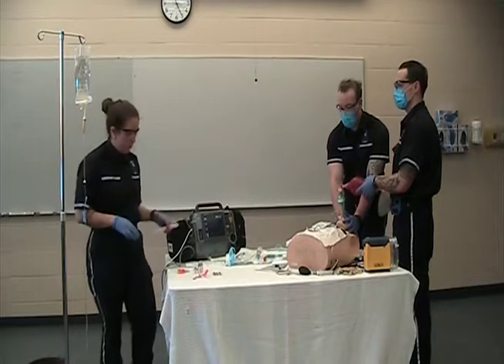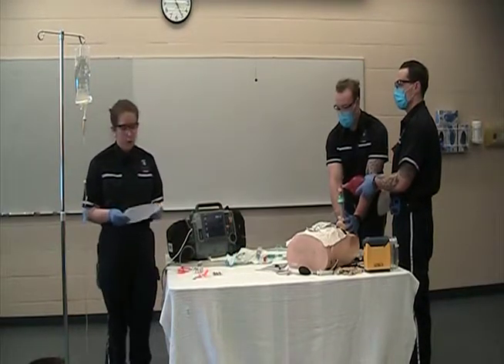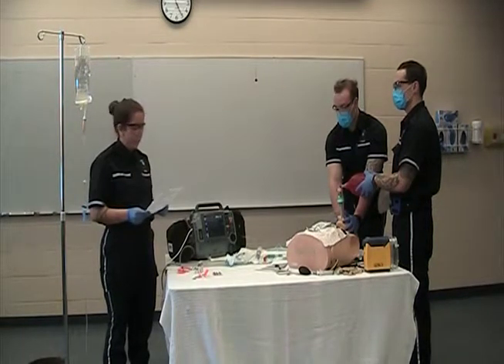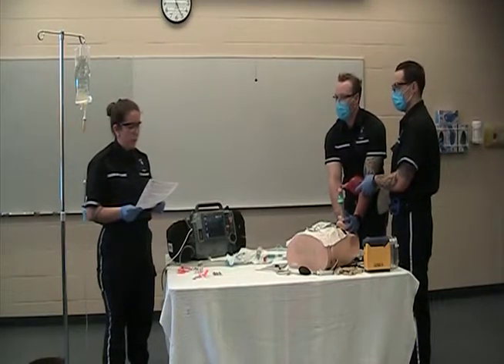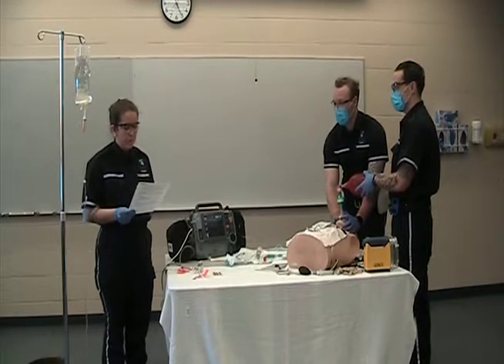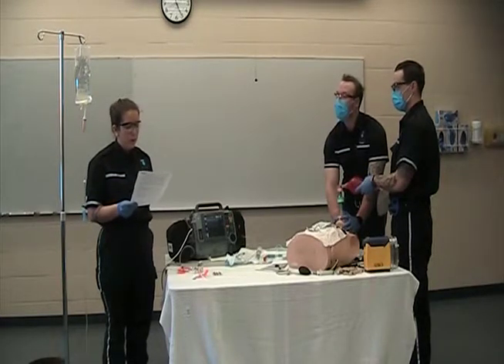All right. Now that we've gone through our pharmacological agents, I'm going to perform the checklist as we do with every intubation, and we'll pre-brief our team and prepare for intubation. So guys, have we performed our LEMON assessment? Yes. And we have our BVM two-man ventilations? Yes. We have our nasal cannula at 15 liters a minute? Yes. Oxygen is flowing? Yes. And they're in the proper position? Yes. Perfect. We all have our PPE on? Yep.